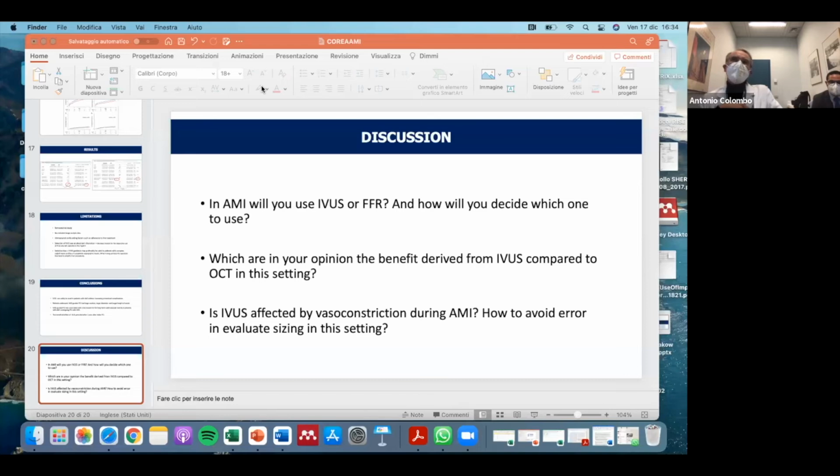No, I think when you use IVUS in acute coronary syndrome or STEMI, before opening the IVUS catheter, you must have a question in your mind, knowing I opened the IVUS catheter to answer this question, which I cannot get the answer to by angiography or by clinical assessment. Not just I do IVUS just to take a look.